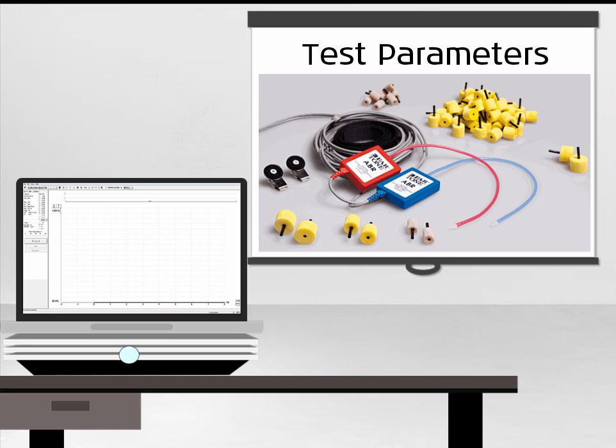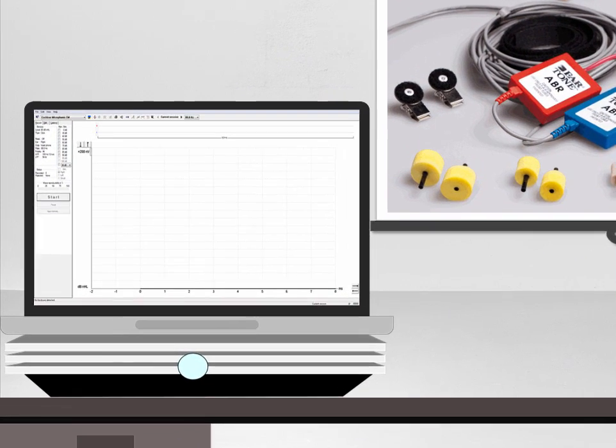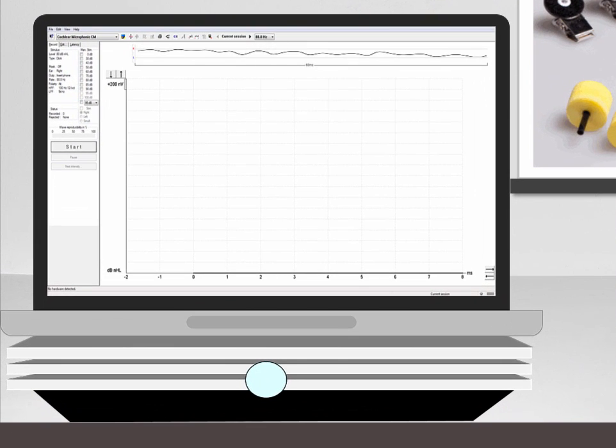With the patient in a restful state and the ongoing EEG low, you can start the test. As the test continues, the cochlear microphonic components begin to come through from the noise. You should continue recording until the noise floor becomes sufficiently low. Recording 2000 sweeps is usually sufficient. Because of the high repetition rate, the test time should be very short.